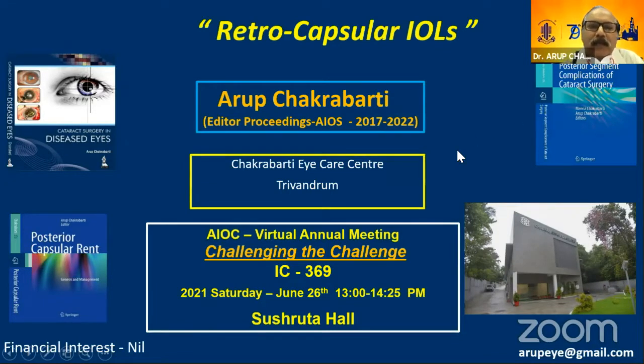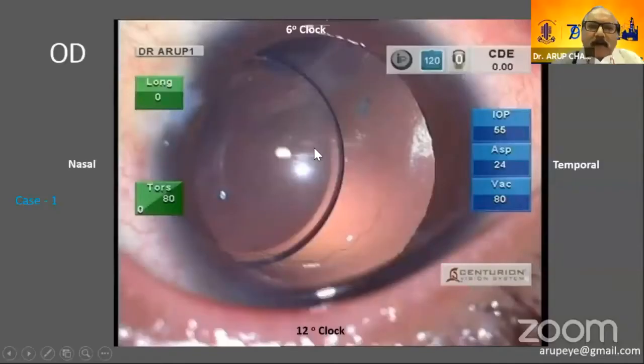kind introduction. I'm going to show you a series of different cases where the lens was behind the posterior capsule, partially or completely, and how we have managed them.